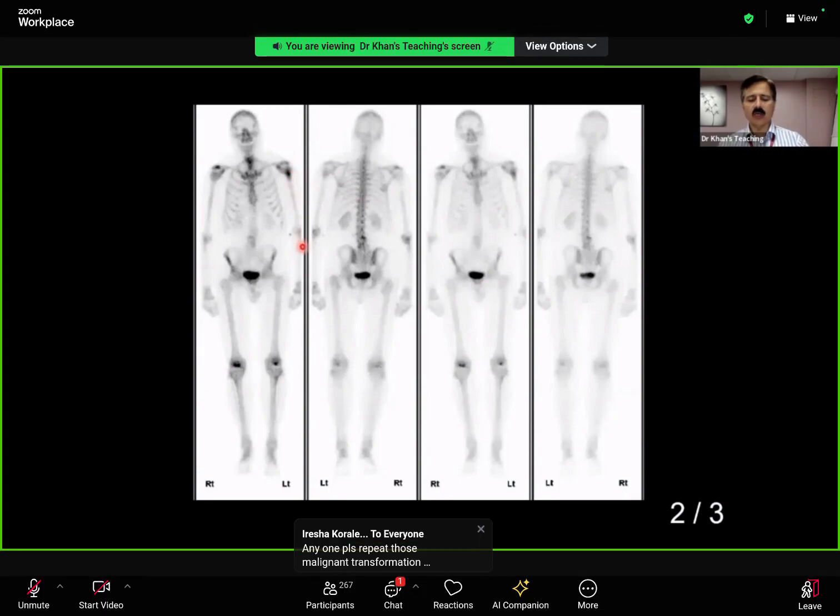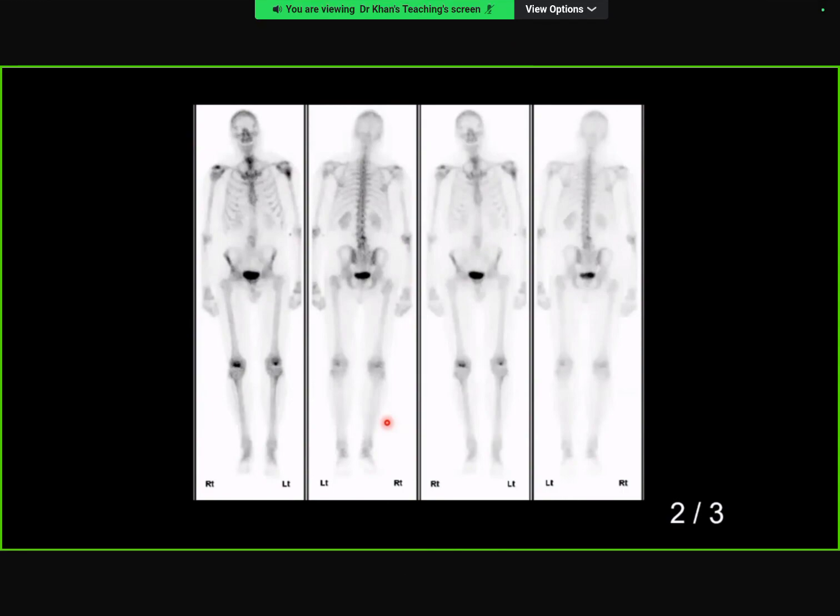What is your conclusion? I'm not sure that the presence of uptake is particularly helpful, because the underlying benign lesion might well take up tracer. FRCR. Excellent.